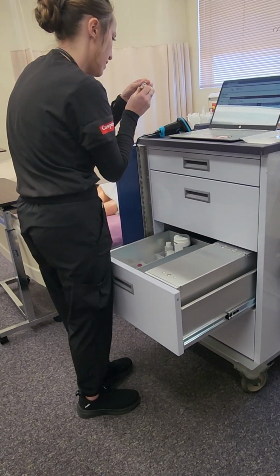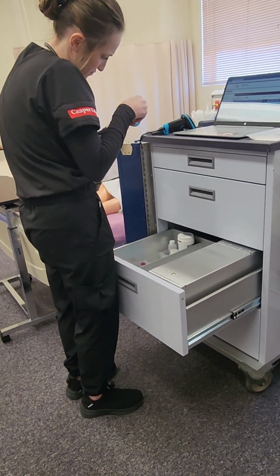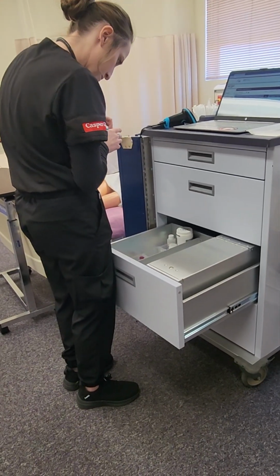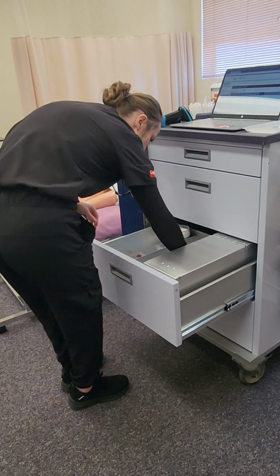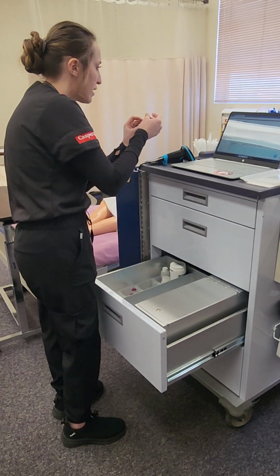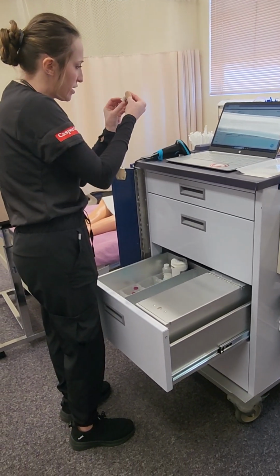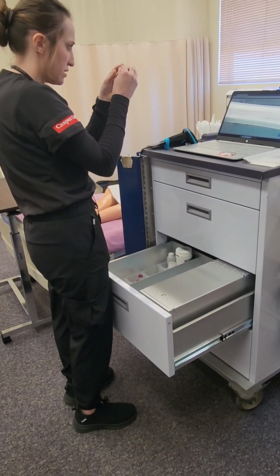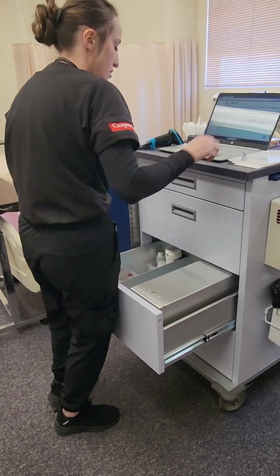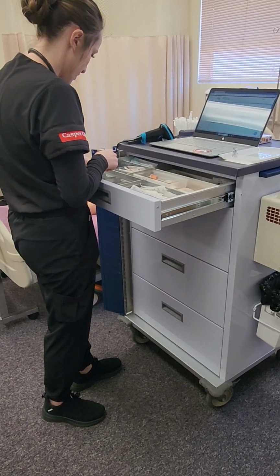Okay, let's see. Oh, I was looking at the wrong heparin. Okay, so I have heparin sodium, 1,000 units per 1 ml. The vial is intact. The expiration is 01/2031. This is going to be a sub-Q injection, so I'll get my supplies for that.